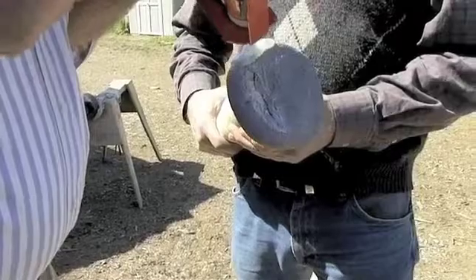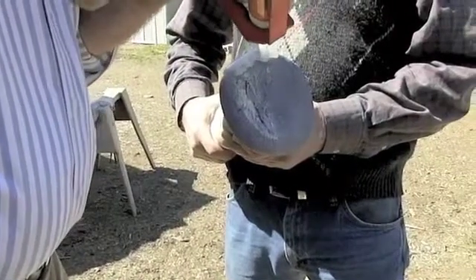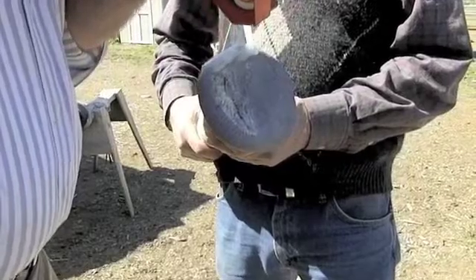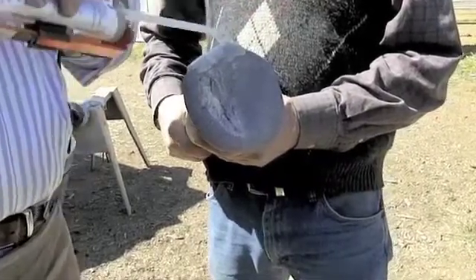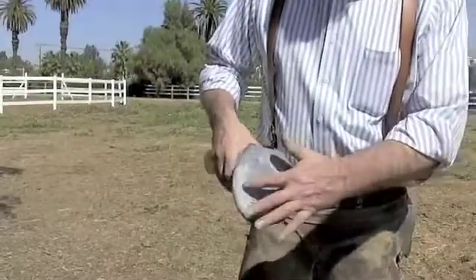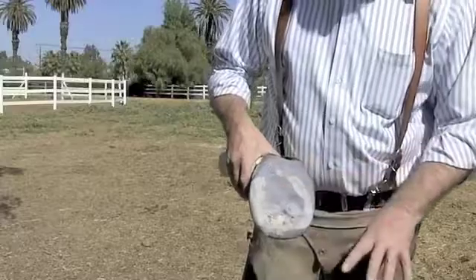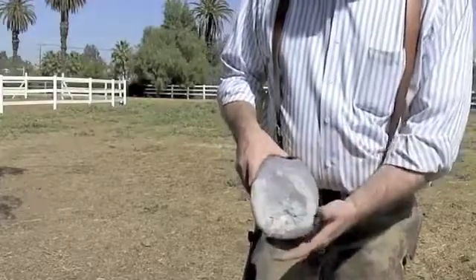It's always good to put a little more material on than you think you need — you can always take it off, or add a little more, though that means using another tip. Try to put on enough the first time. Here we're going to demonstrate how, by cutting the foot up into segments, we can see the medial-lateral balance of the foot.